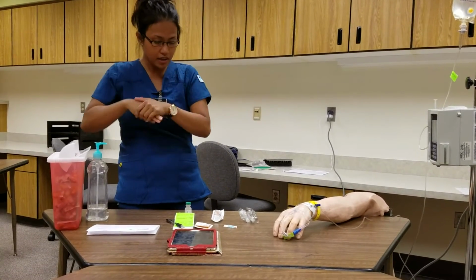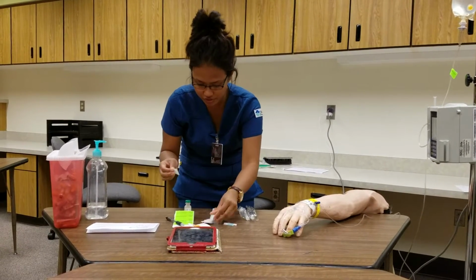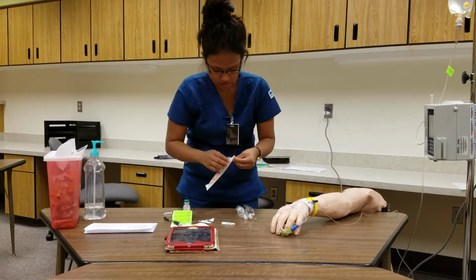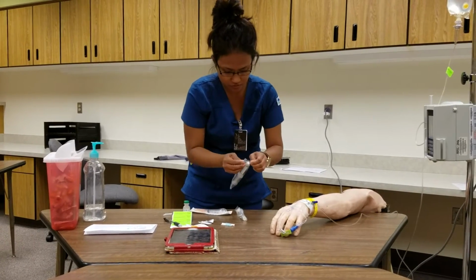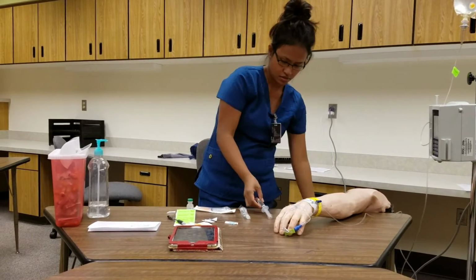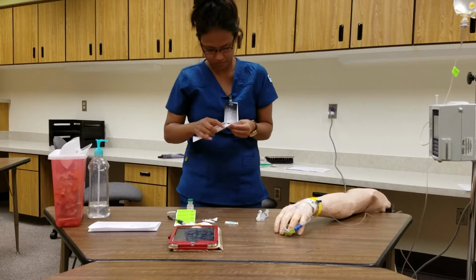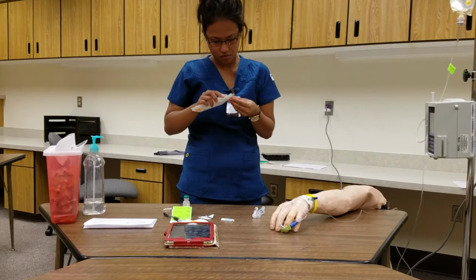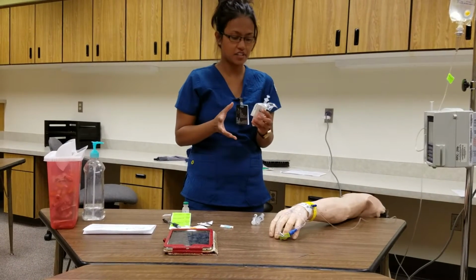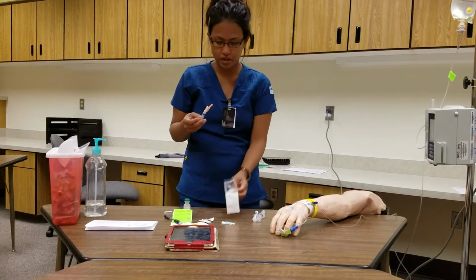So I would wash my hands, and I would want to clean my vial first. Cleaning my vial, and since I am drawing up, I get all my stuff ready. I want to make sure I have a trash can next to me. After I check all my supplies, if it's not expired and not tampered with, I'm good to go. So I have 1 ml.